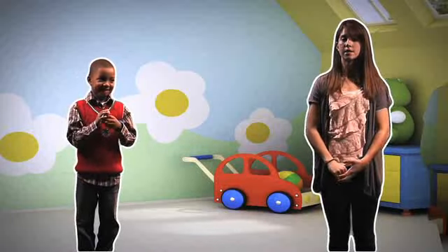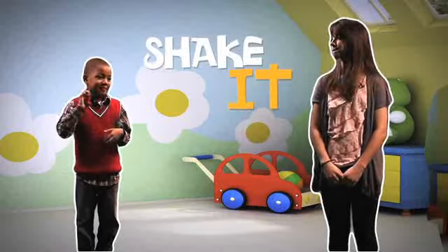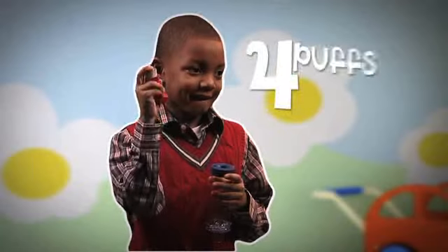Here's the most common way to take asthma medicine — the metered dose inhaler. The first thing you want to do is shake it. If your inhaler is new or you haven't used it for a week, prime it by spraying four puffs into the air.